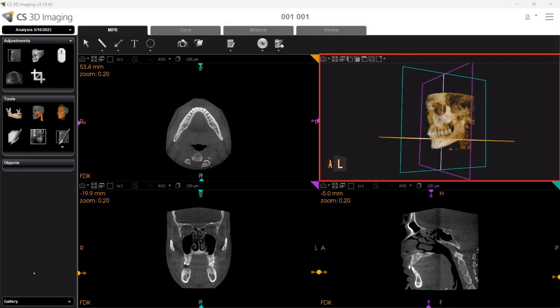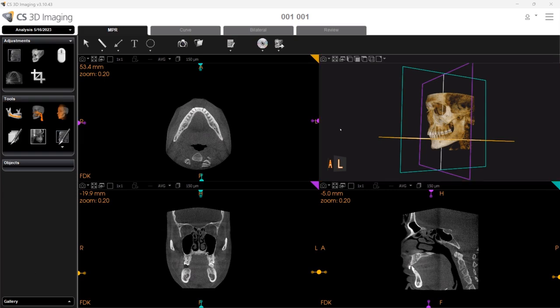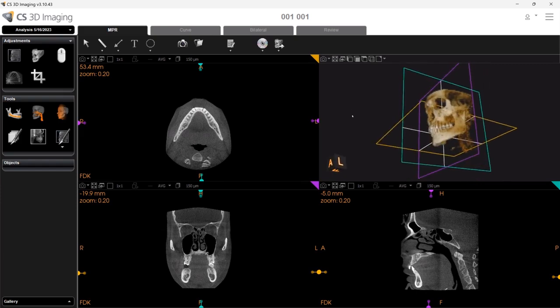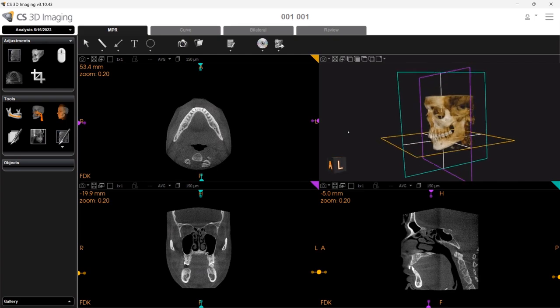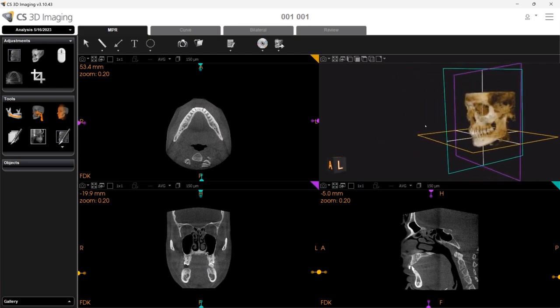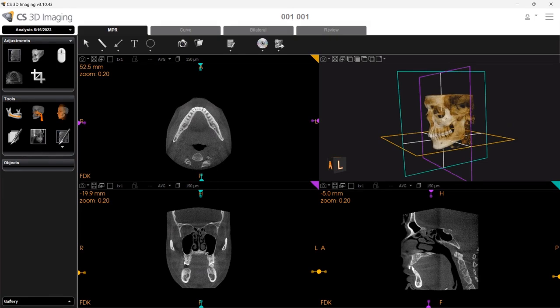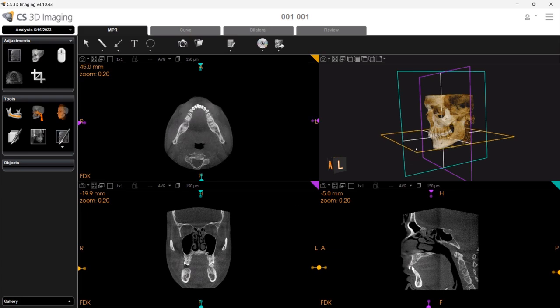Lastly, the 3D scene provides a rotatable three-dimensional view of the 3D volume. Left-click and hold to rotate the 3D scene. Or, right-click and hold to move the entire 3D scene. You can also right-click and hold on the corner of a colored plane to adjust the plane views.